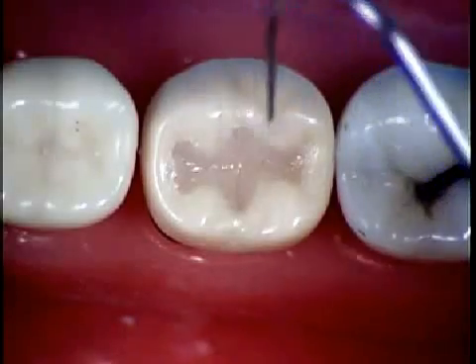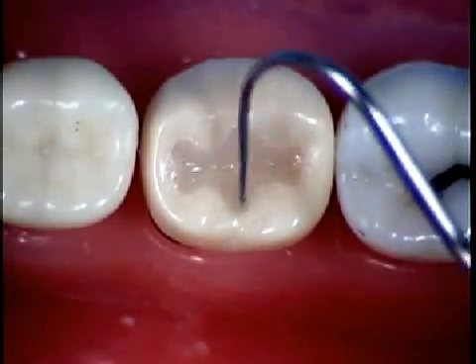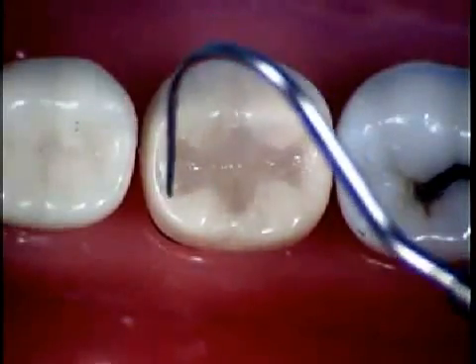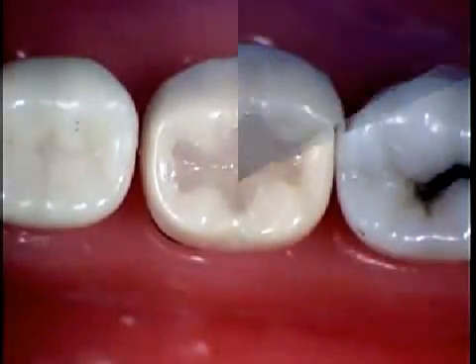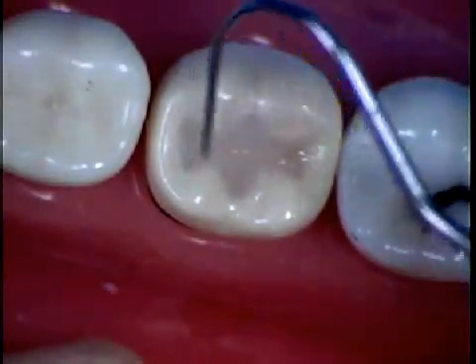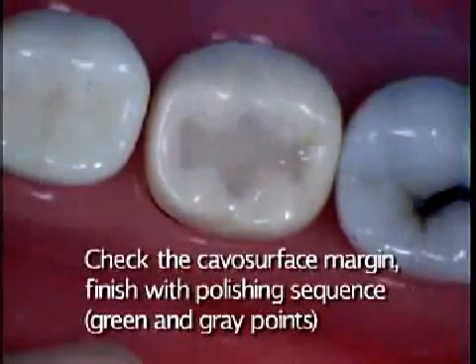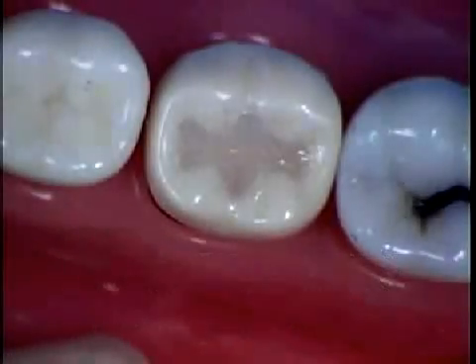After you rinse and dry, go back and check your margins to make sure that you have no excess or defects. If there is a little excess, go back and remove it with a bur. After you remove the excess, go back with your explorer and check for a clean cavosurface margin. Then finish with the polishing sequence of green point and gray point.